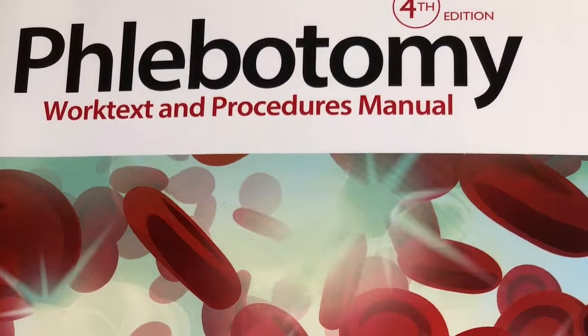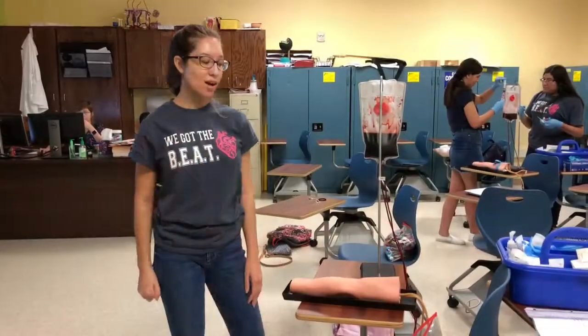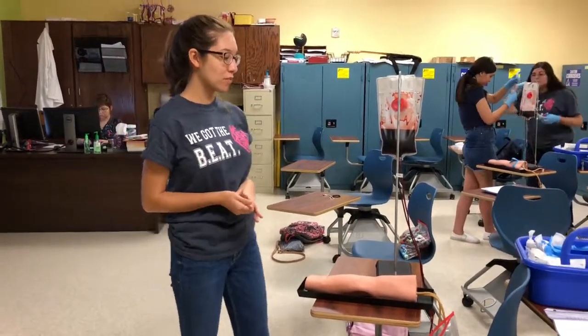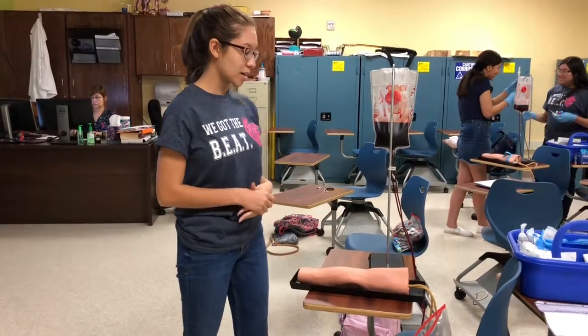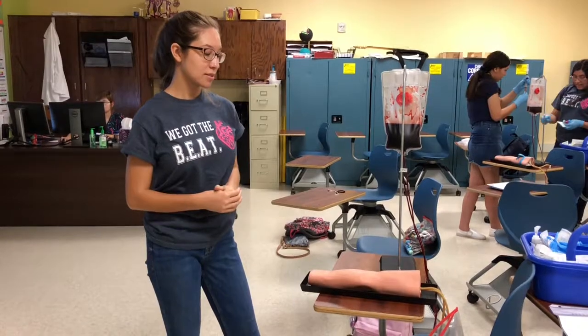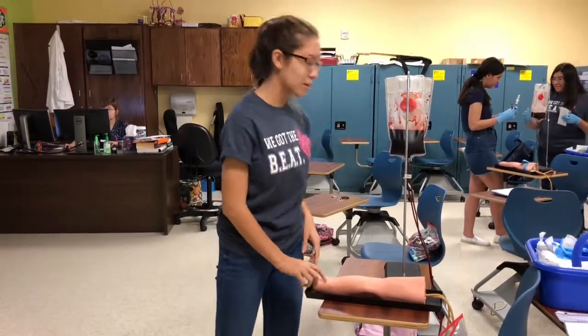My name is Samantha Lahr and I'm going to be showing the venipuncture technique on a mannequin arm. First, I introduce myself to the patient. Today I'm going to be performing a venipuncture technique. Can I get your name and date of birth? Clarissa Jaramillo, 9/19/2000. Now I'm checking the hospital ID band to verify her identification.